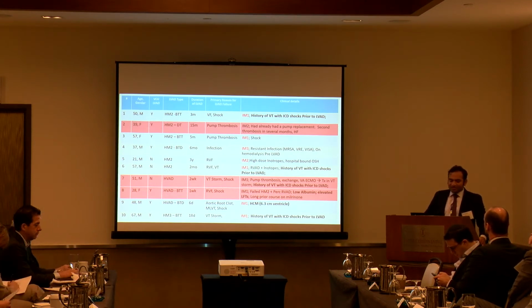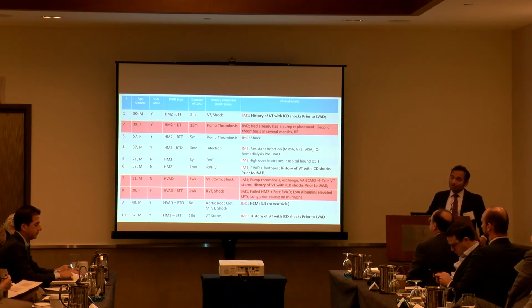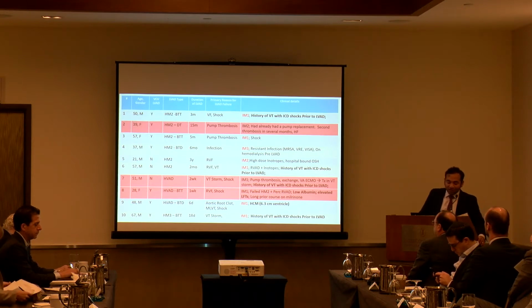In the 4th column, it says LVAD type, so all of these were continuous flow devices, and predominantly the patients implanted with a TAH were also, at the time of implant or LVAD failure, bridge to transplant candidates. 1 was a bridge to decision, and 1 was a DT patient initially that became a bridge to decision, and then when things didn't go well, suddenly looked like a good transplant candidate. The duration of time on LVAD support before LVAD failure was generally short. Most patients were on the device for about 3 months before they developed complications that we thought needed replacement with the TAH.